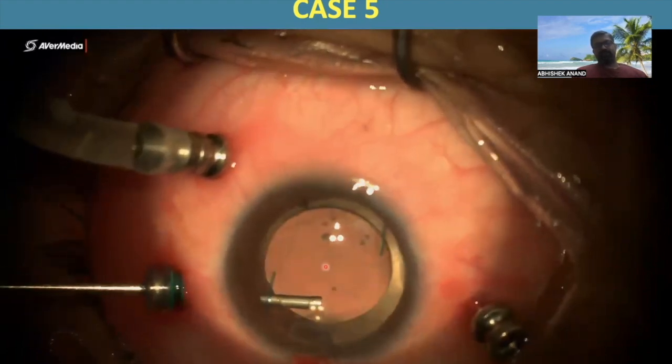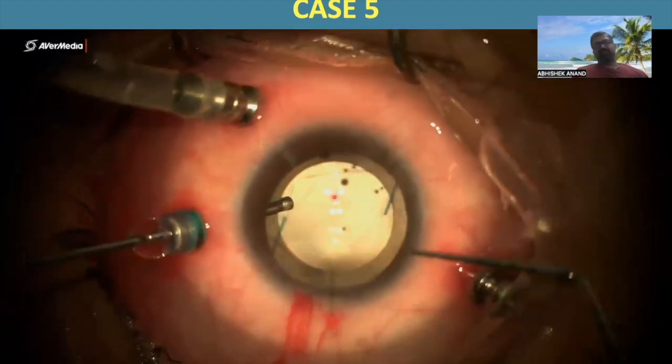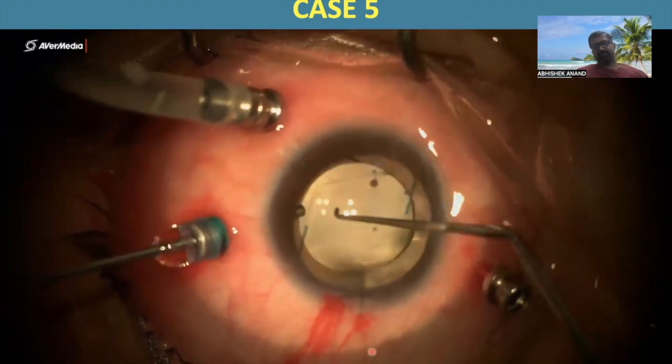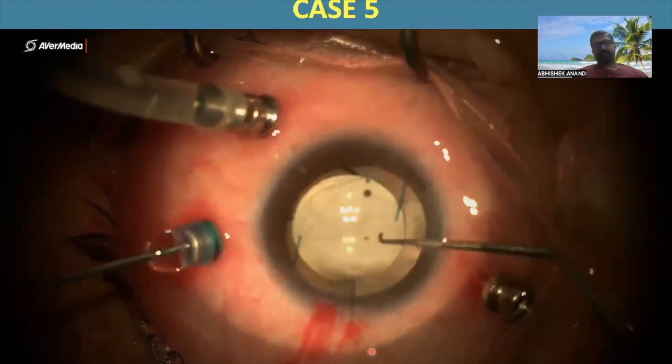After the complete removal of this, the next steps are very easy, in which I try to capture the IOL in the capsulorhexis. We do an optic capture, and then we proceed with the usual three-port pars plana vitrectomy with removal of the dropped hemi-nucleus.